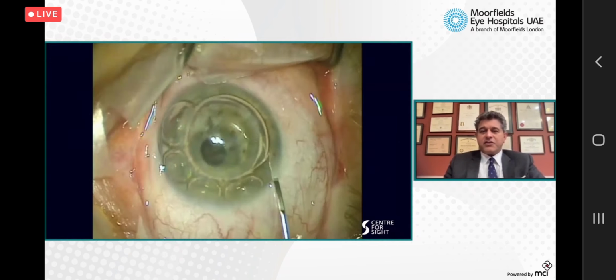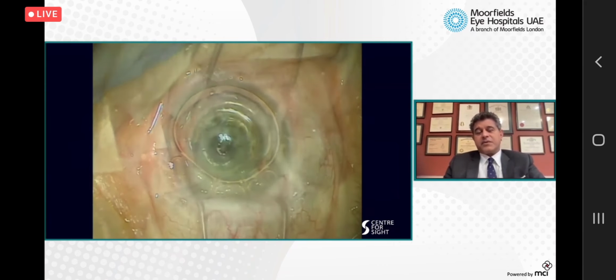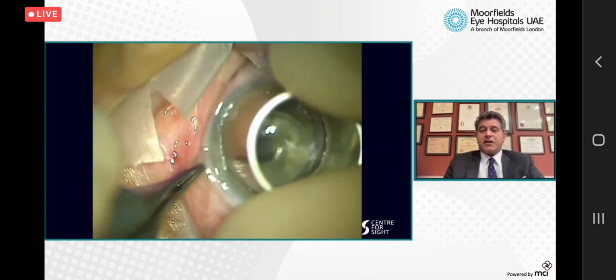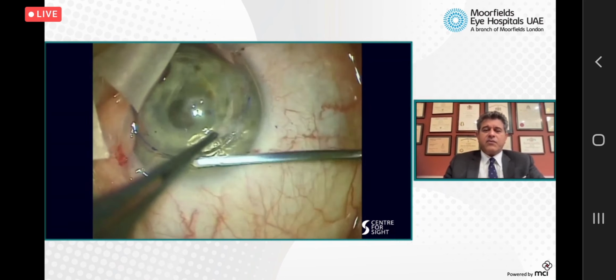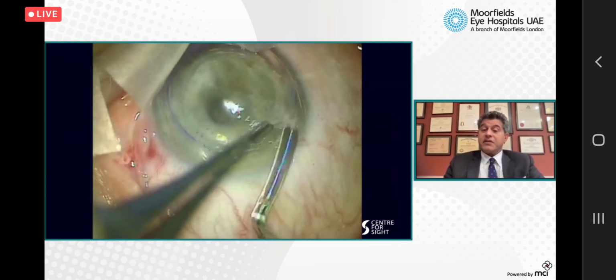Another option is to do a deep anterior lamellar keratoplasty on a previous PK. Our first case was to try and beef up the whole cornea so we could do a central penetrating keratoplasty. But to our amazement, the patient did very well and developed 20/25 vision unaided afterwards, even with a cell count of 600. So we now do this as a standard procedure.